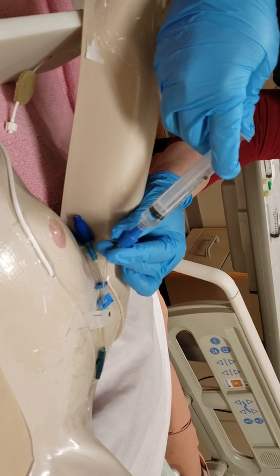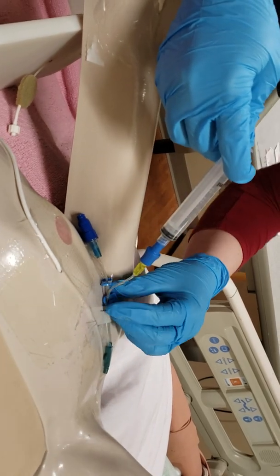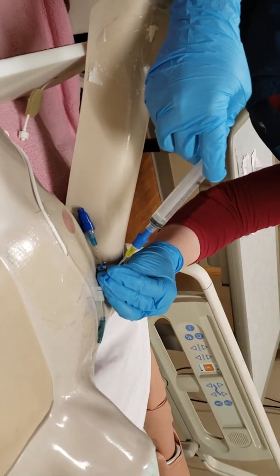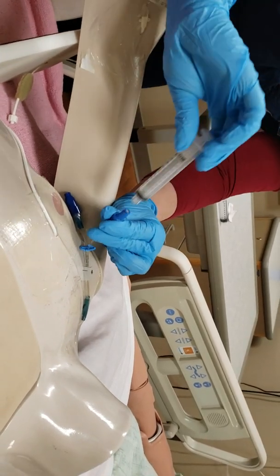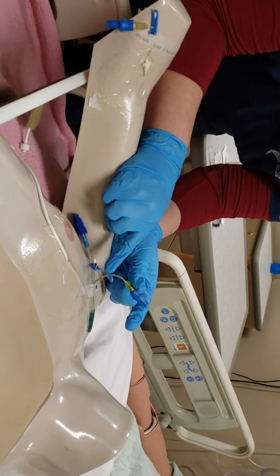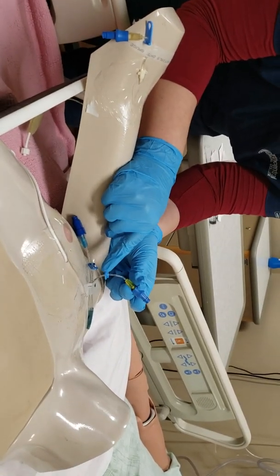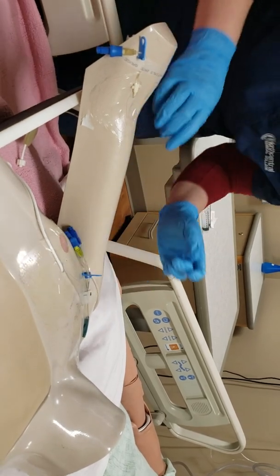This is just going to flush that line and really give it a good flush. Make sure that nothing is in there and then it remains patent. I'm going to go ahead and remove my flush. Before I removed my flush, I did clamp it again so that nothing can backflow.